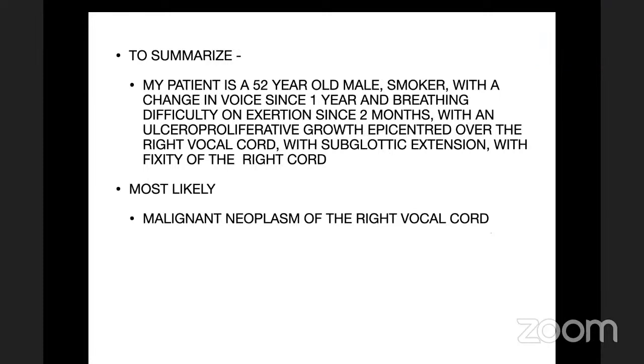Okay. KK, is that a correct answer? I don't fully agree. I thought when the tumor crosses the ventricle, the glottis crossing the ventricle to the supraglottis, or the supraglottis coming across the ventricle into the glottis, it's transglottic. Ratan and Sharbani, just correct me.